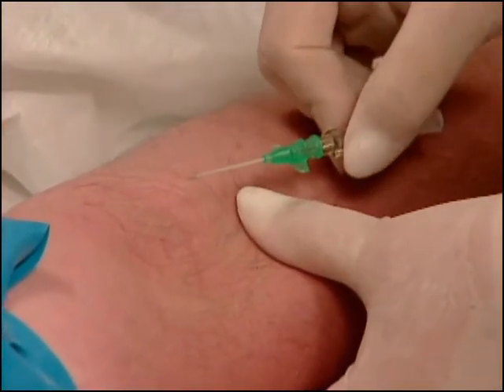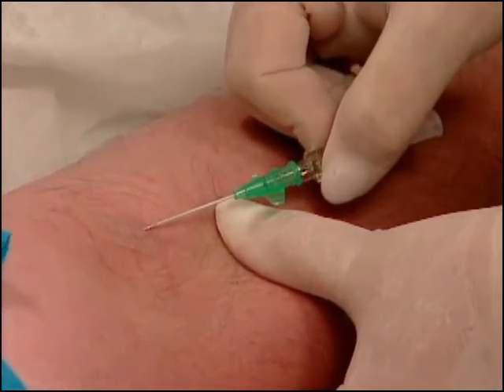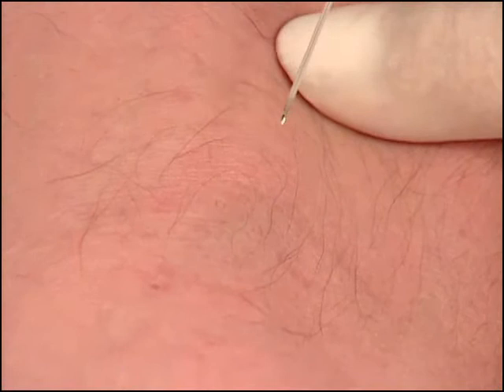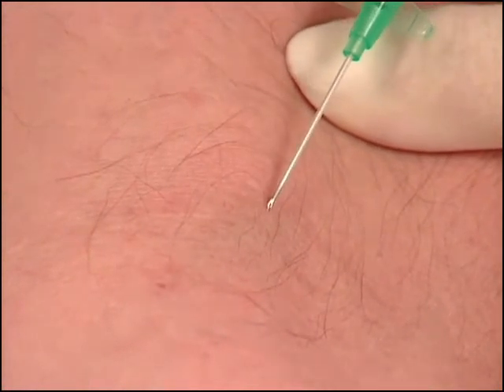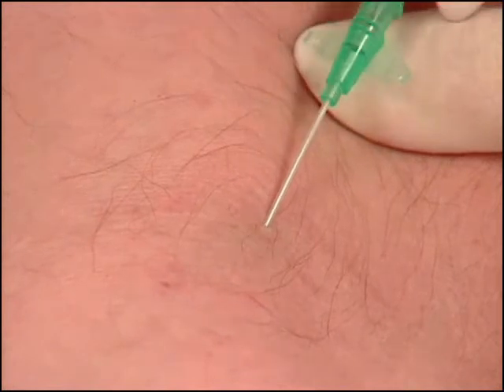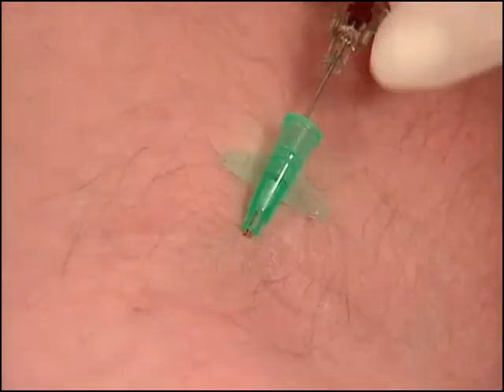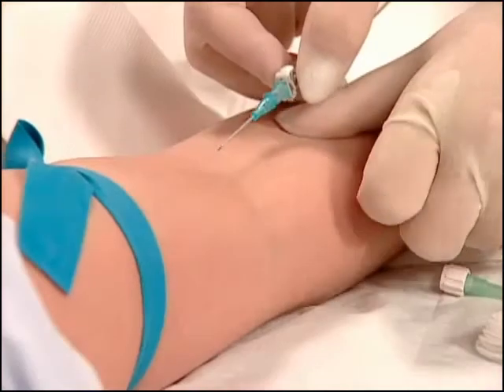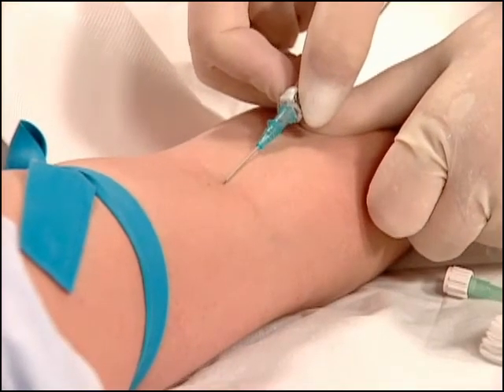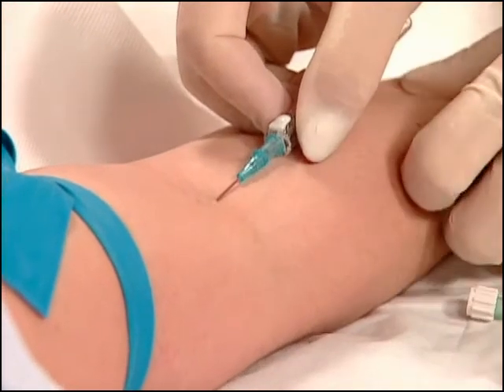Use your thumb to gently stretch the skin over the insertion site. This will help to stabilize the vessel. Hold the catheter in your dominant hand and turn it so that the bevel is facing up. Inform the patient of the imminent stick to decrease the likelihood of the patient moving while the catheter is being inserted. Quickly insert the catheter at a 10 to 30 degree angle into the vessel. Look for a flash of blood in the chamber. Advance the catheter approximately 1/3 of a centimeter or 1/8 of an inch after the flash is seen in order to seat the catheter in the vessel.